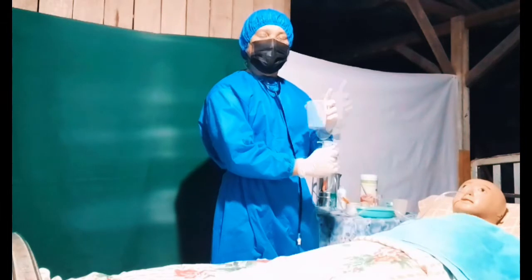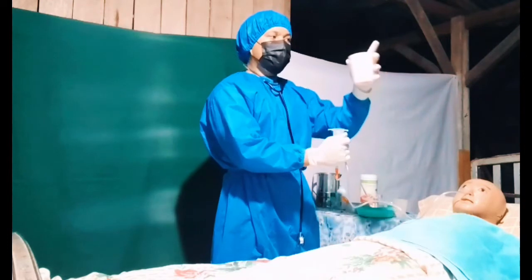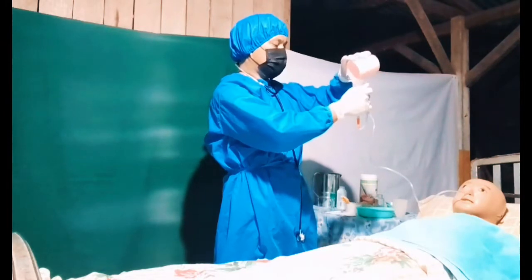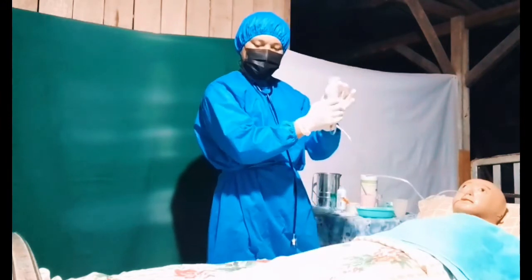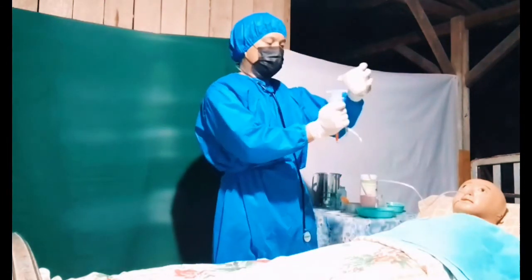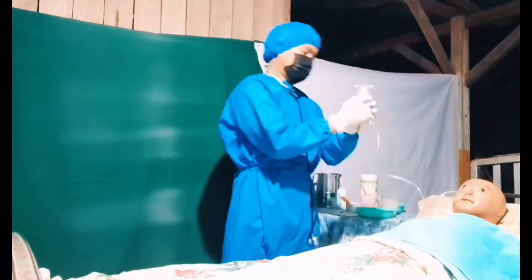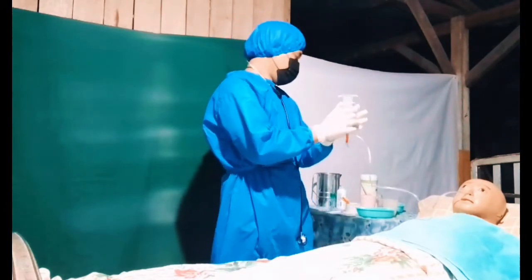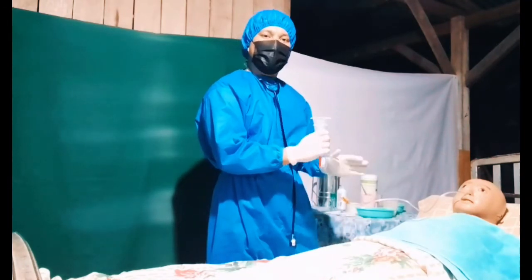So, in the doctor's order, the Insure is 20 ml. So, assuming that this is 20 ml, we're going to put it right here and let it flow. After that, you're going to put some 30 ml water for flushing. And then the medication, the 30 ml medication for the patient.